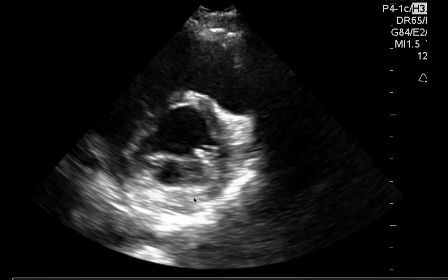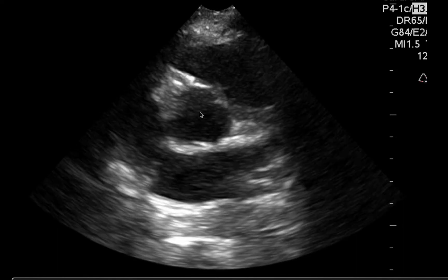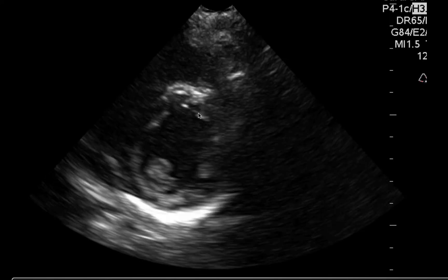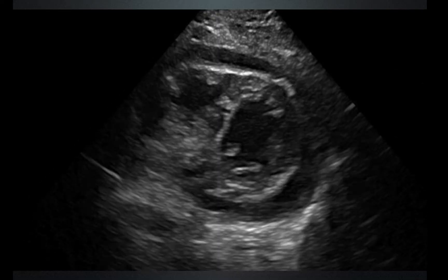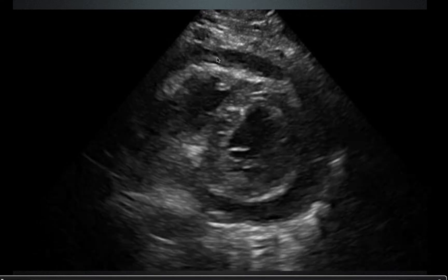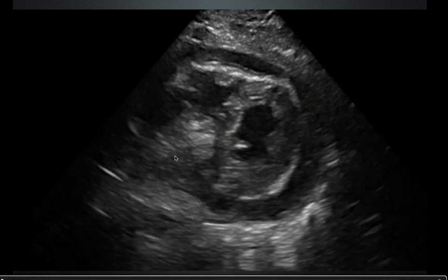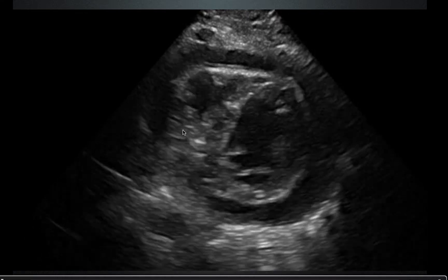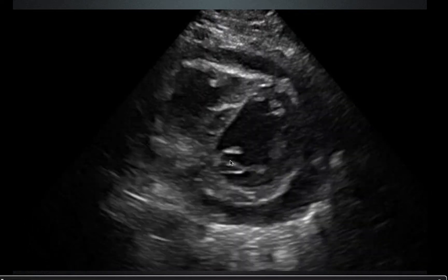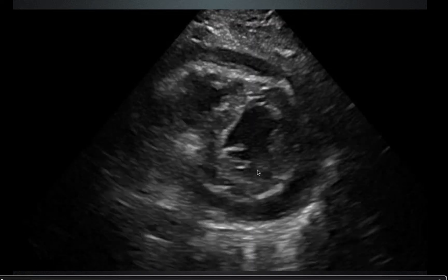The parasternal short view: tilting up toward the patient's head gives the aortic valve, and tilting back down gives the mitral valve, which looks like a big fish mouth opening and closing. This is a good view for assessing contractility and for pericardial effusions — if fluid wraps all the way around the heart rather than just on the right ventricle, it's a pericardial effusion rather than a fat pad. This heart is a little limited by a pacemaker causing reverberation artifact off the back wall, but the left ventricle ejection fraction appears decreased at less than 50% but greater than 20%.